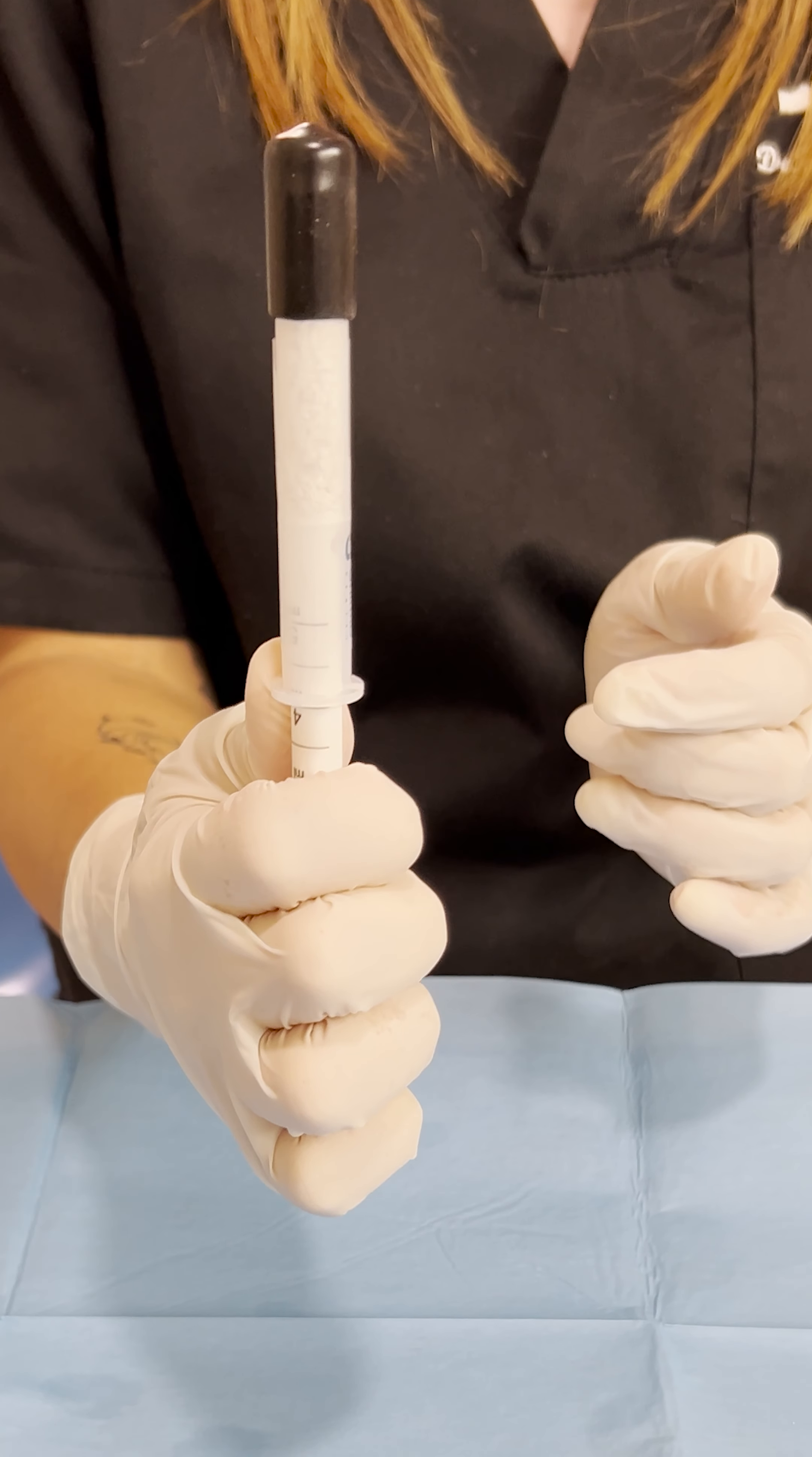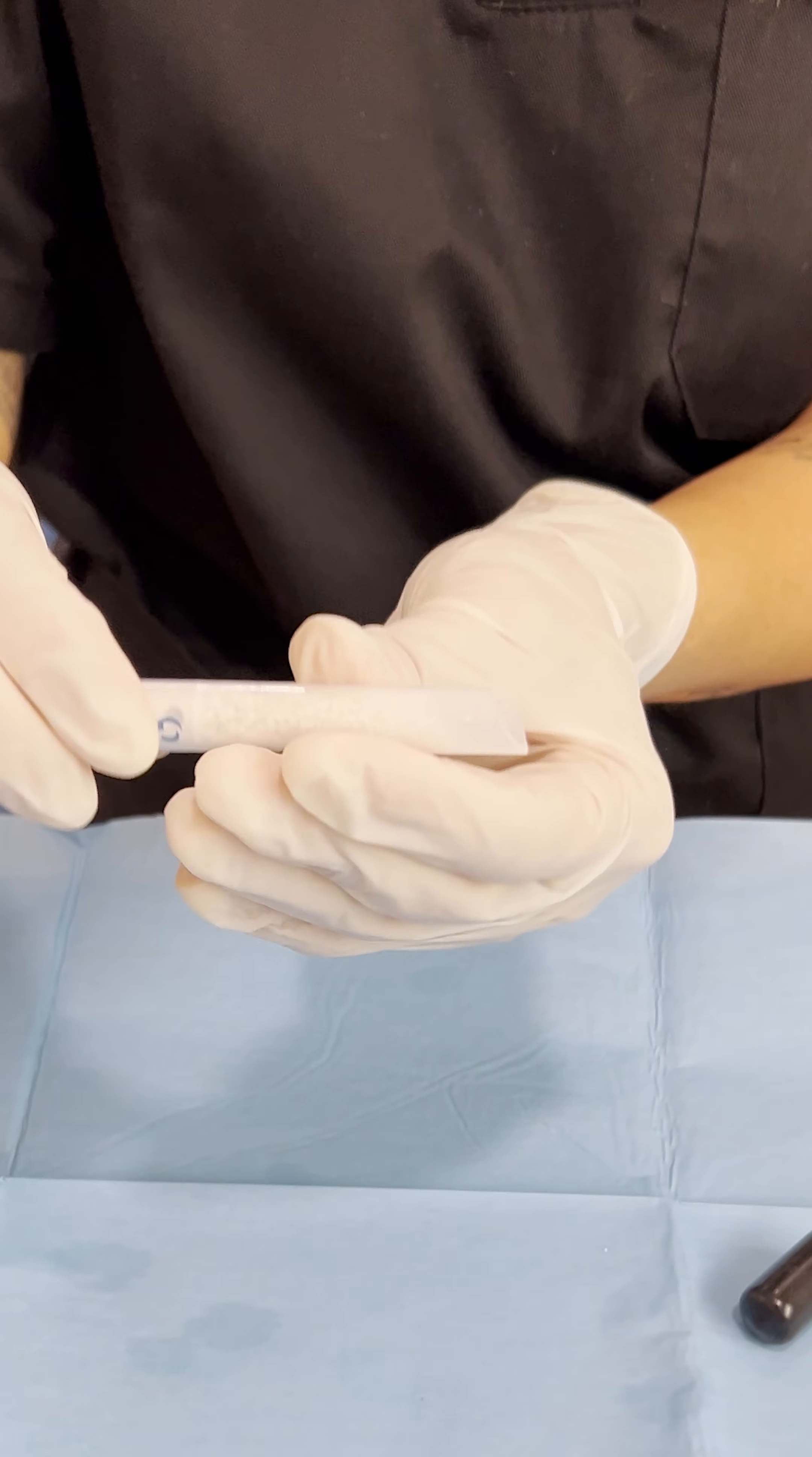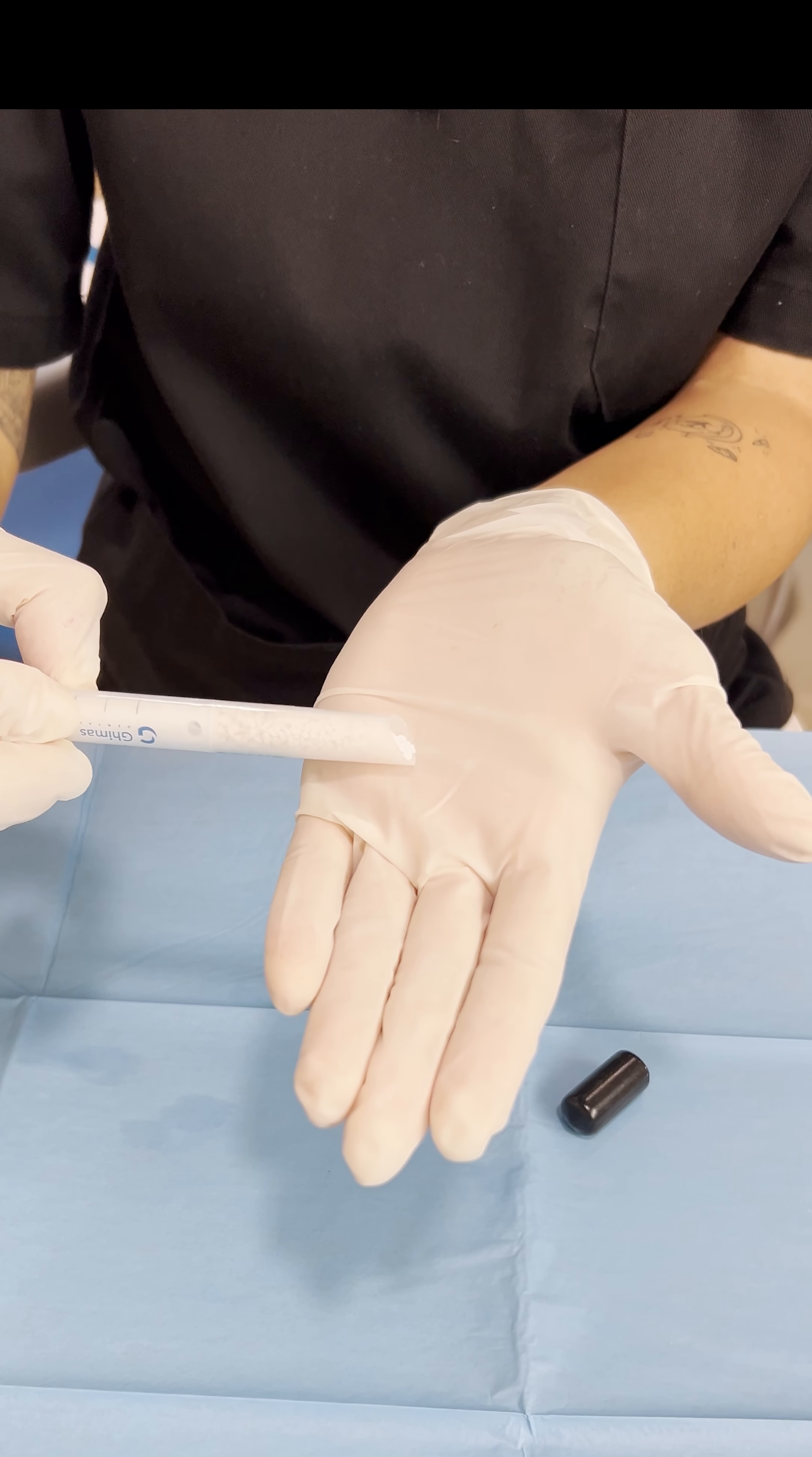This is how we open it. As you can see, we have a longer edge so we can easily put the biomaterial inside one-handedly, and push the biomaterial inside of the defect.